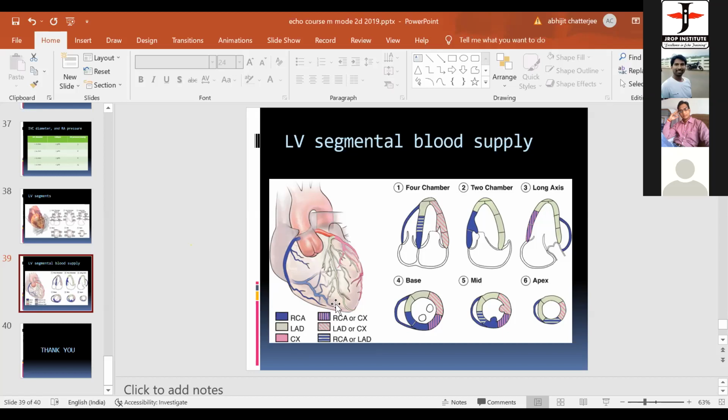Dr. Samrat Sukumar. Good evening, sir. Very nice presentation, sir. Very concise presentation. Sir, I had a couple of questions. My first question is, sir, in myocardial performance index, do we always need to use tissue Doppler imaging? Can it also be properly validated with the use of continuous wave Doppler? My another question, sir, is in the measurement of the aortic valve annulus, especially in very stenotic or very heavily calcified aortic walls, sometimes we underestimate the valve area. So are there any tips or tricks in this heavily calcified wall to measure the aortic annulus?